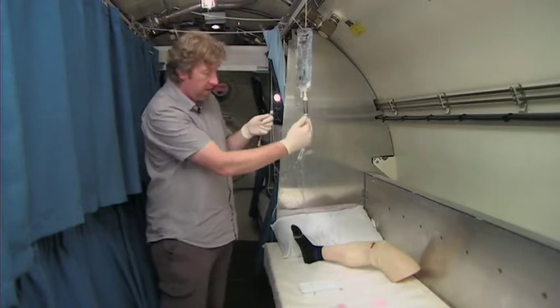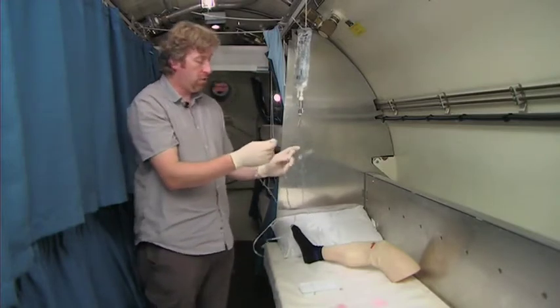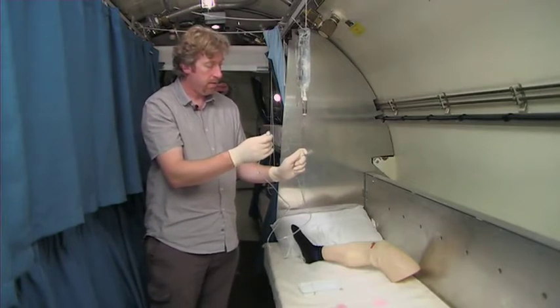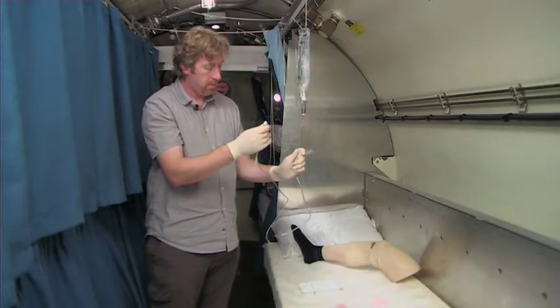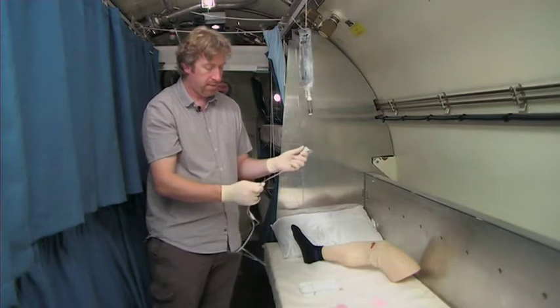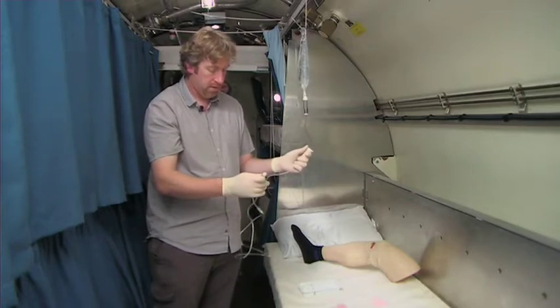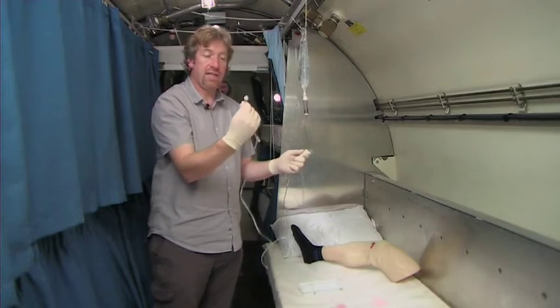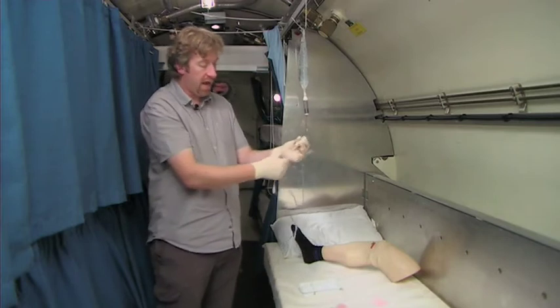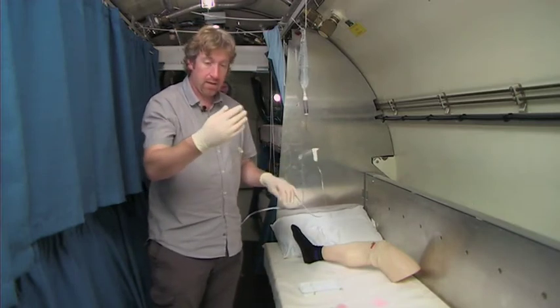We then need to fill the tubing with fluid. So what we do is slowly open up the roller clamp and watch the fluid drip through the tubing until it reaches the end. When it reaches the end, close off the cap and just have a quick check to make sure there are no air bubbles as we get the fluid close to the end of the column.